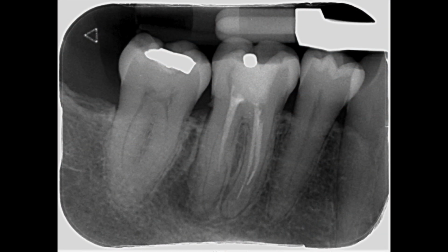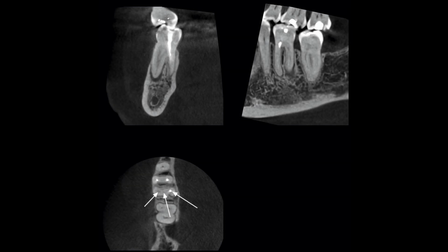Here you can see the preoperative radiograph of the mandibular right first molar. An attempt at root filling has already been made, however they've run across some difficulties. There's a couple of fractured instruments in the mesial canals, and the distal canal just doesn't look quite right. I exposed a CBCT to check this out, and in fact the distal root has 3 separate canals.